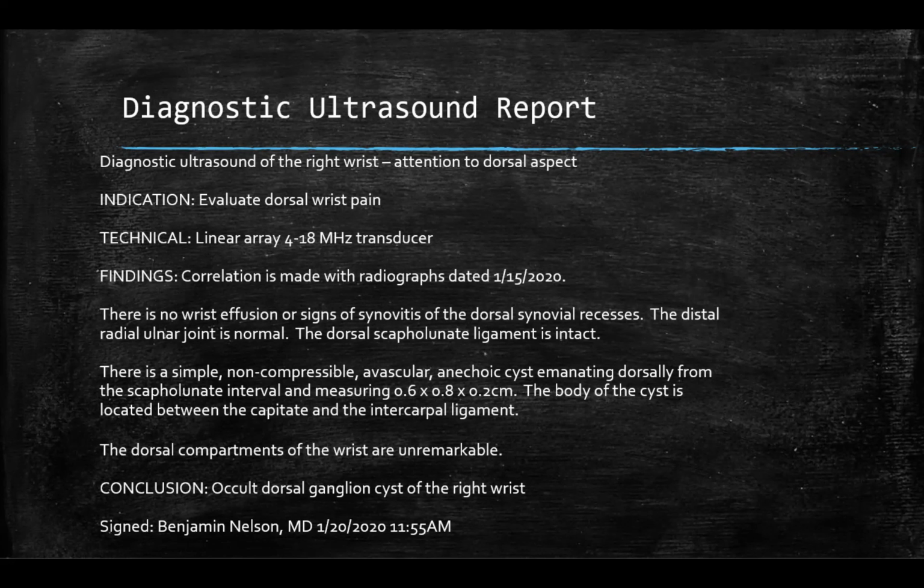Yeah, thanks, Doug. One of the papers that I read mentioned that before the widespread use of ultrasound, the most common way to identify occult ganglion cyst was on exploratory surgery. So ultrasound has really been a game changer for the identification and treatment of ganglion cysts.